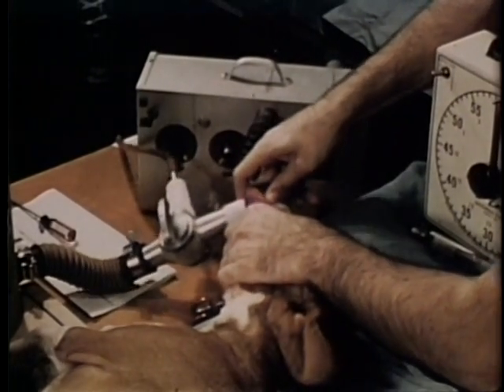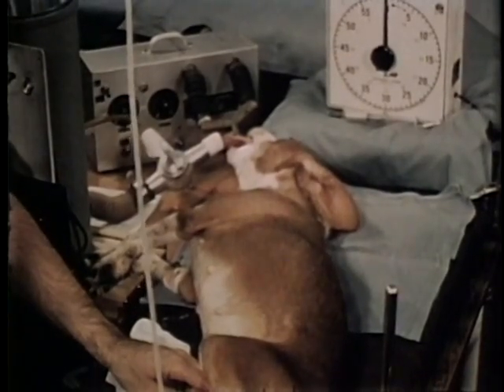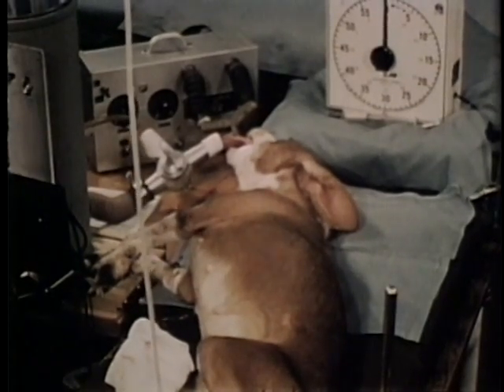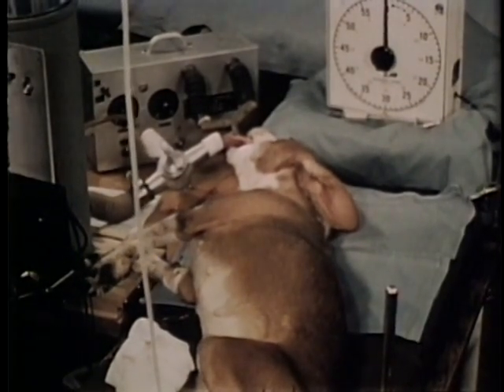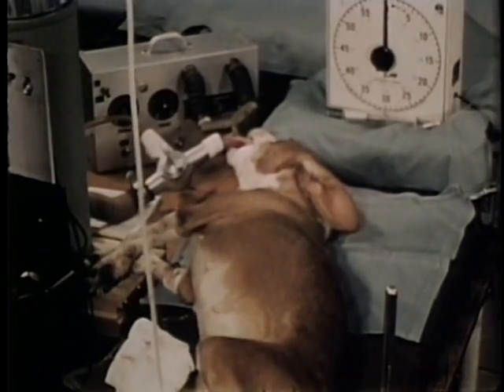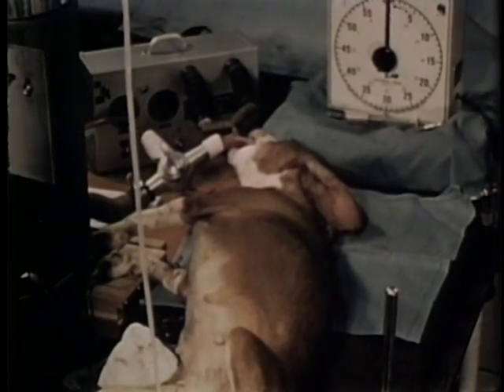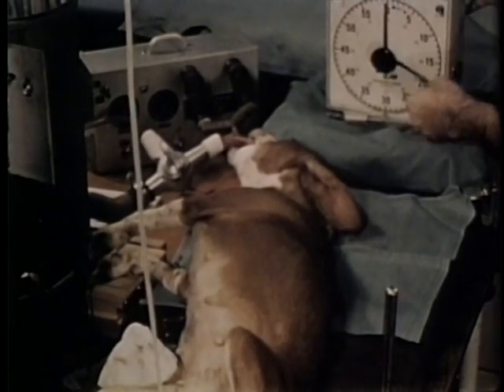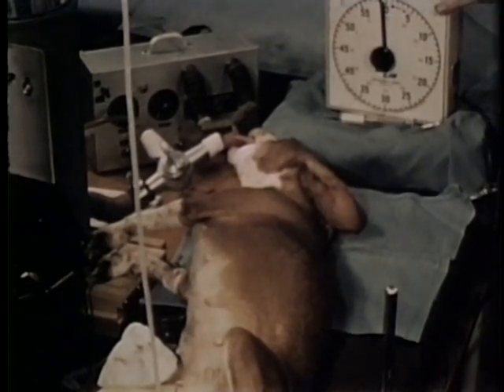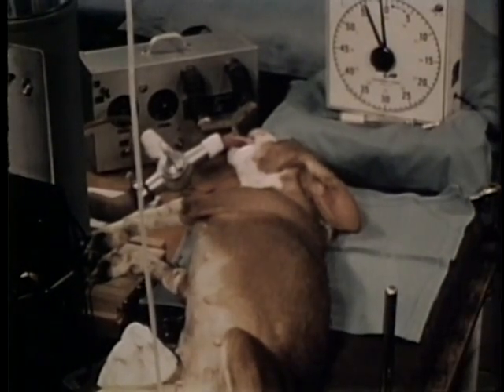Complete relaxation of the dog is obtained by intravenous administration of divided doses of succinylcholine, 1/2 of a milligram per kilogram, as needed. Here we see the deep, regular respirations produced by ventilation of the paralyzed animal. The timer is turned to zero, started, and ventilation with 100% oxygen will continue for 1 hour. During that time, all the necessary preparations will have been completed.